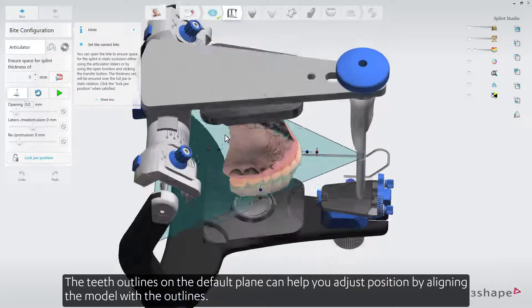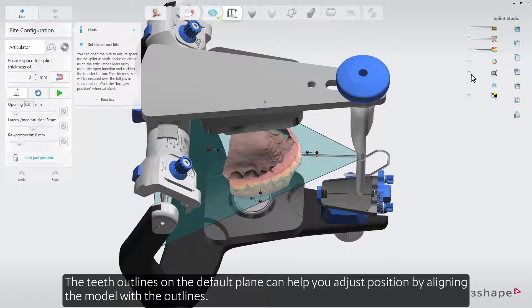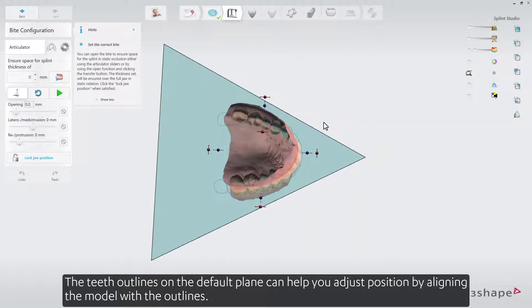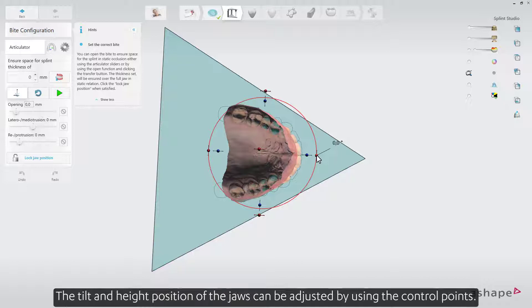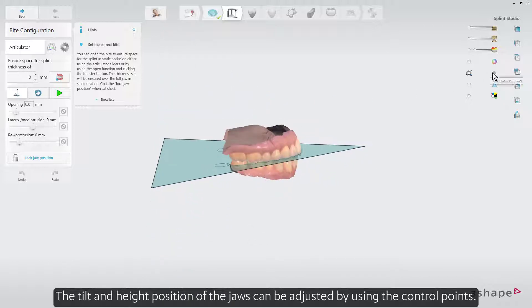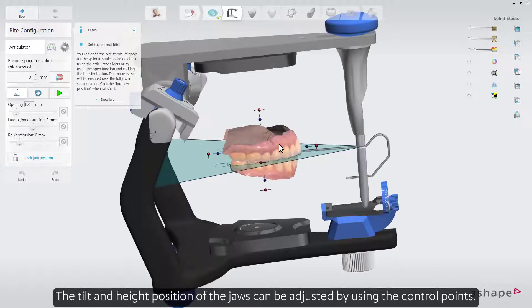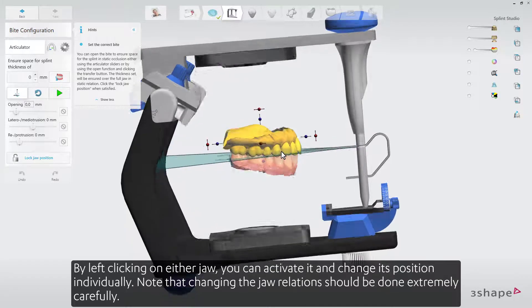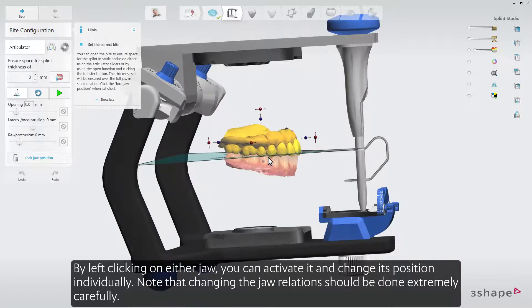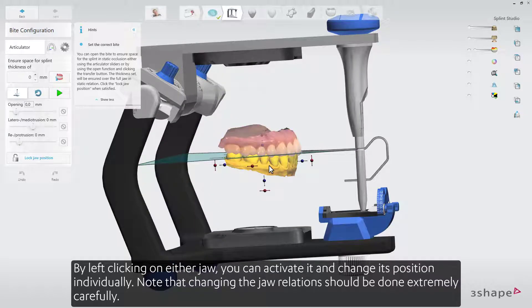The teeth outlines on the default plane can help you adjust position by aligning the model with the outlines. The tilt and height position of the jaws can be adjusted by using the control points. By left-clicking on either jaw, you can activate it and change its position individually.